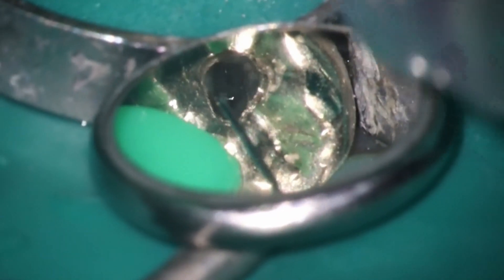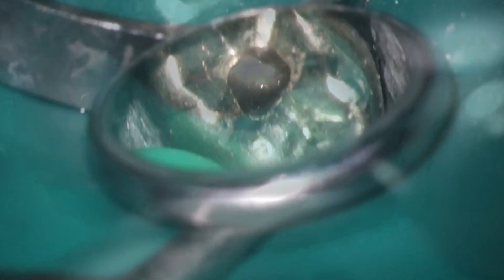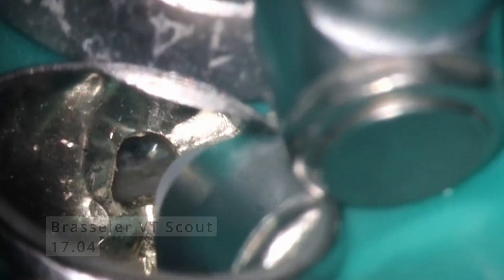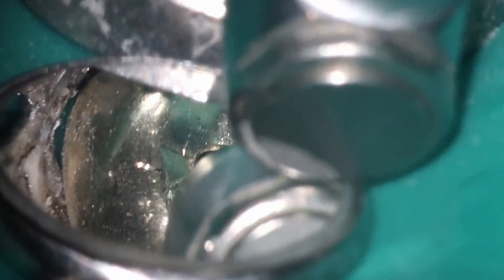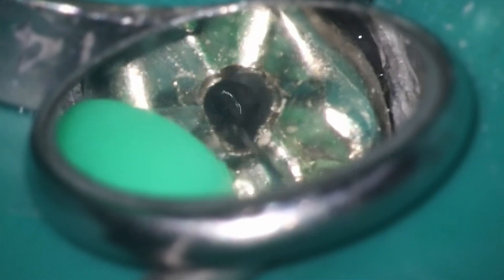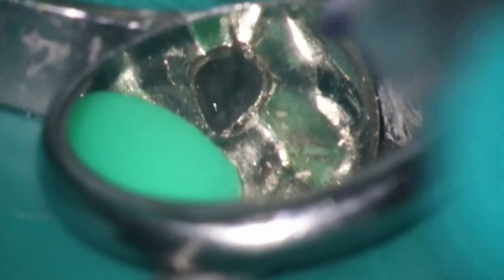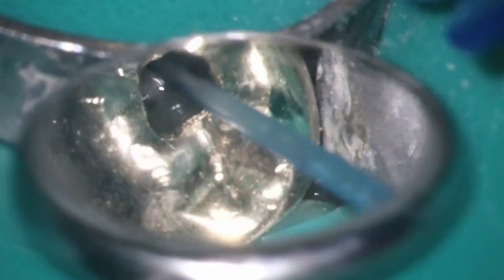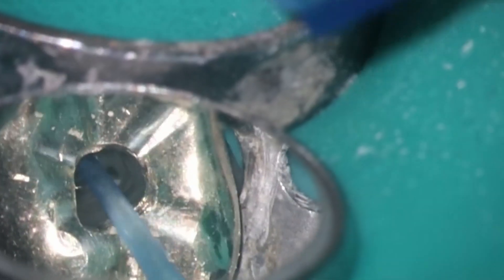Rinse with Triton, get all that nastiness out of here. This is a case where I wasn't sure if I was going to be able to finish it in a single visit or if it was going to require multiple. Thankfully, it was pretty straightforward — able to get everything nice and dry. I have found that with these longstanding infections, once there's a sinus tract, there's usually continual drainage if the patient isn't in pain, and then it's very easy to get everything dry inside the tooth, which makes it predictable as far as obturating the case. So lots of rinsing here. It was a little bit calcified, so I started with the 2006 and then took a 17 down to within a few millimeters of the working length that I got off the cone beam.